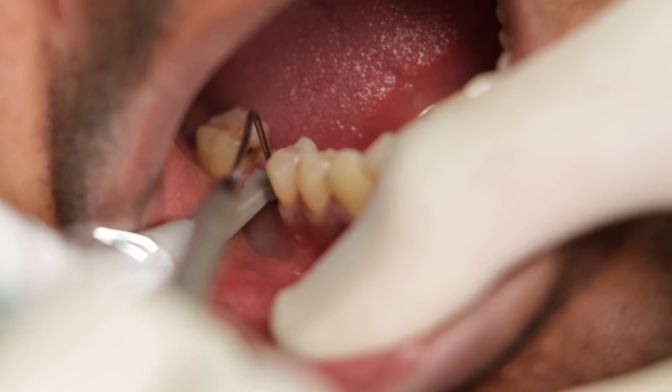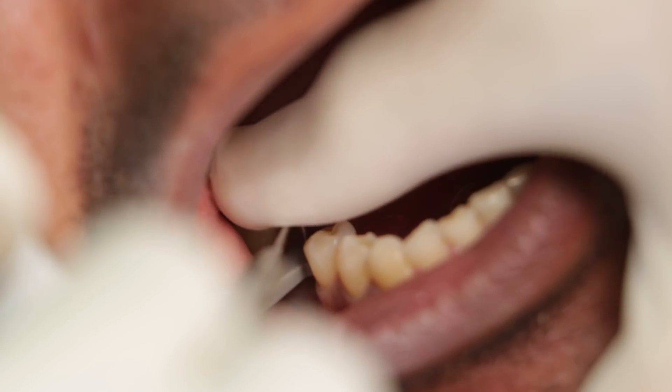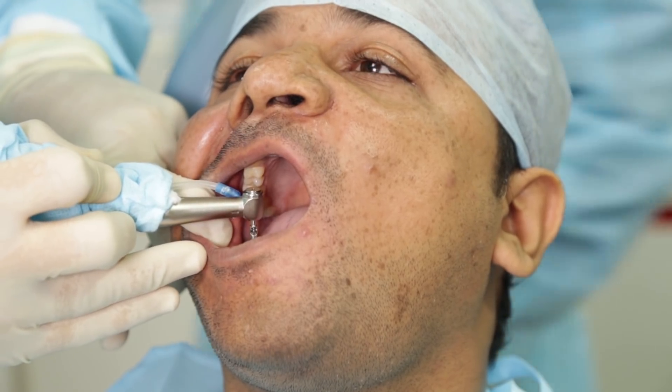Once I reach my final implant position, I will hold the locator in place and my assistant will get in a straight probe which I will use to mark that site. I have a corresponding tissue punch already autoclaved and ready. I will use this around the marking to cut the tissue and expose the implant.